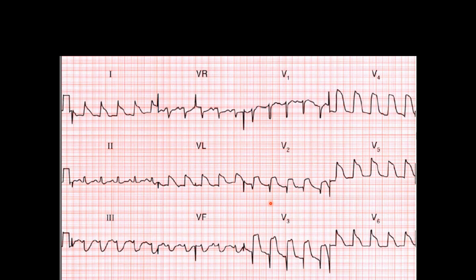Whenever we say this is elevated, we are talking about from the reference of TP segment. So TP segment के हिसाब से हमने देखना है कि ये ऊंची है, so this is elevated. So always look for the TP segment because that is your isoelectric point. TP segment is your isoelectric point. So इस लाइन से ये देखें आपके कितना ज़्यादा एलिवेटेड.